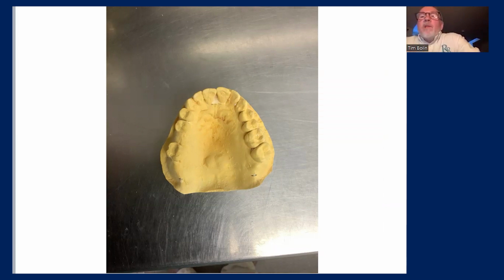Quite often when we're working with a hinge axis articulator and we need a flat plane appliance and we've got a reasonably deep overbite, let's say 5 millimeters, then opening them up on a hinge axis articulator becomes problematic. I don't know if you've ever had the experience of sending a case like that to the lab and then having results come back where they just opened it up and you've got to start grinding the bejeebers out of the case. That's just really not necessary.